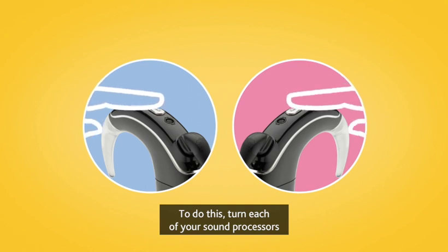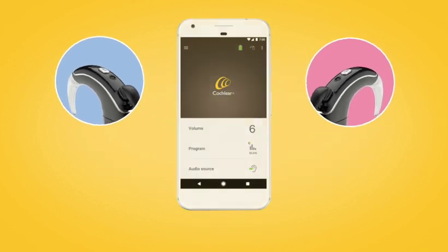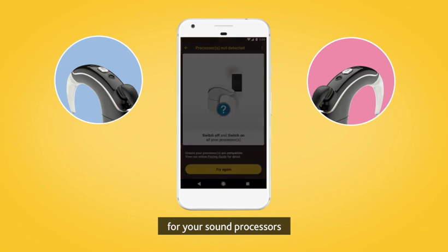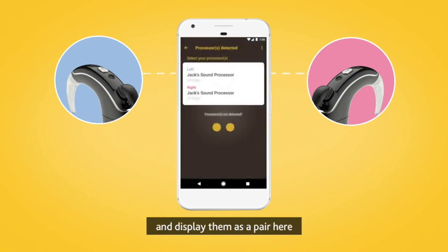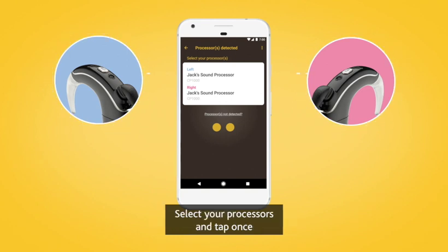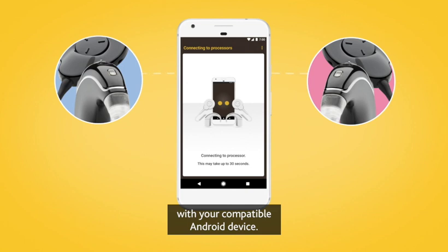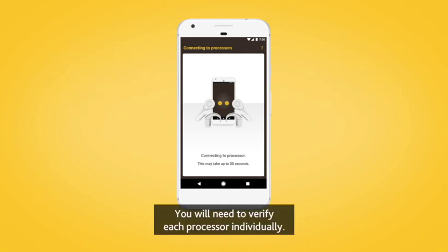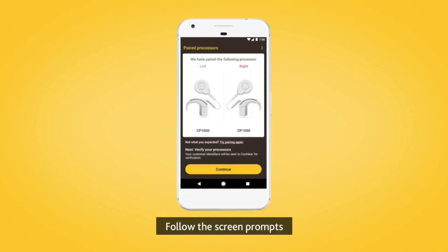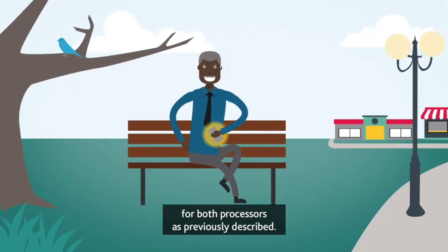To do this, turn each of your sound processors off and back on again. Your compatible Android device will search for your sound processors and display them as a pair in the Processors Detected screen. Select your processors and tap once to begin pairing them with your compatible Android device. You will need to verify each processor individually. Follow the screen prompts to complete verification and pairing for both processors as previously described.